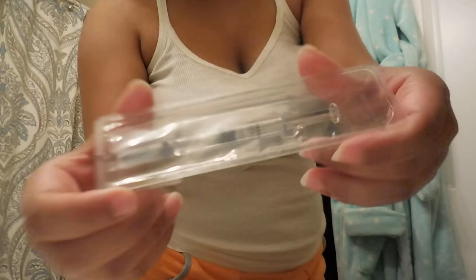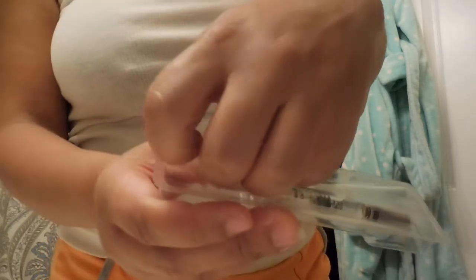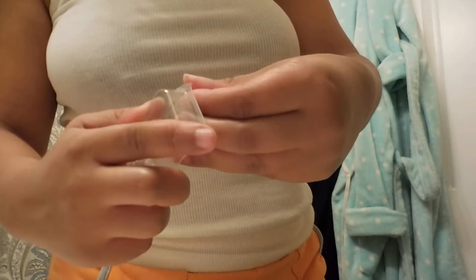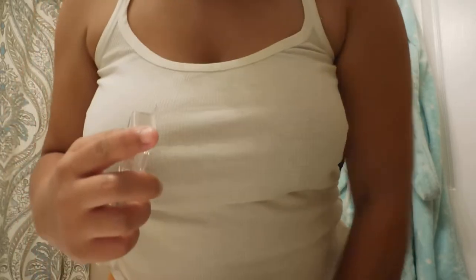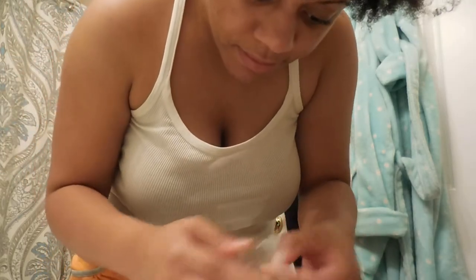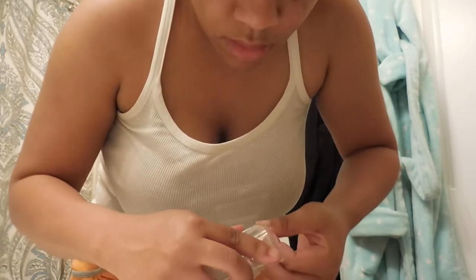This is how it comes — with instructions and things like this. This is how I do this. You can open it up. Some towel. There.